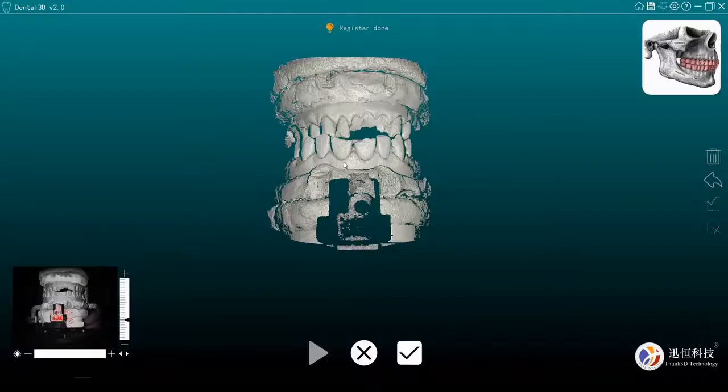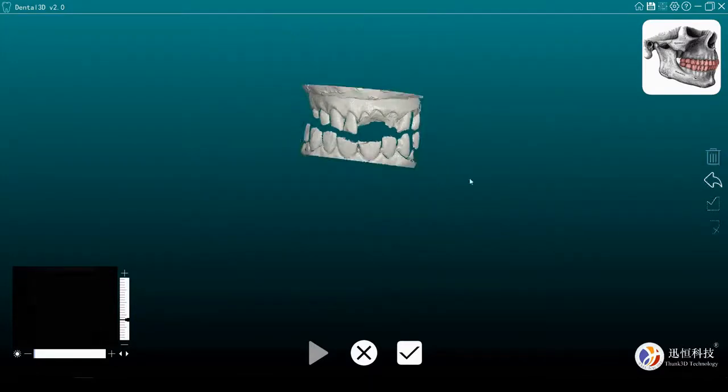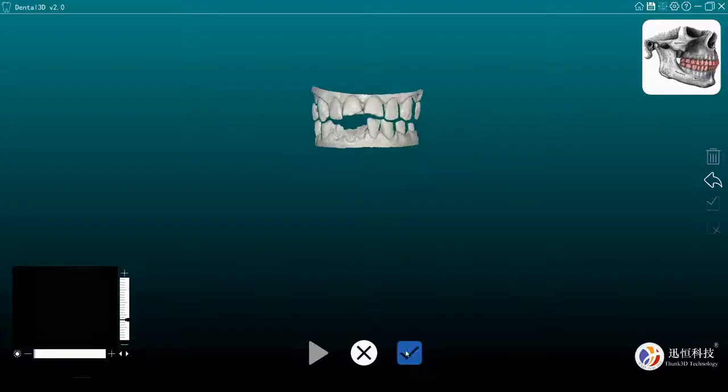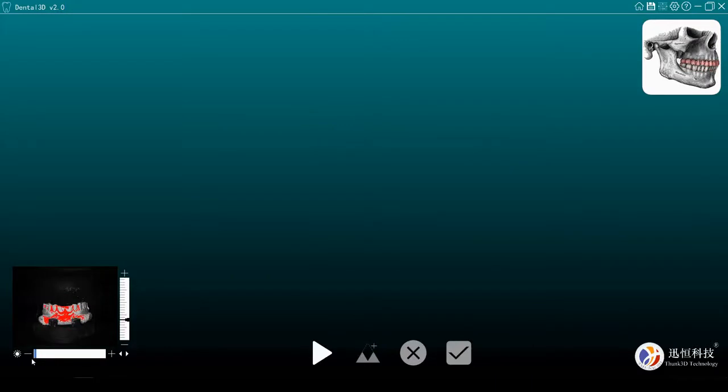Yes, DT300 is a very compact and integrated scanner. It can't support the articulator turning on the turntable. 1 scan could meet some users' requirements, but not all users'. It all depends on whether the 1 scan could get as many features as it could. For this model, 1 scan is quite good.